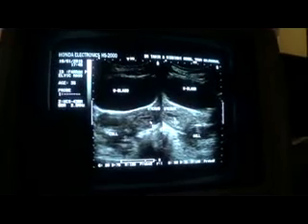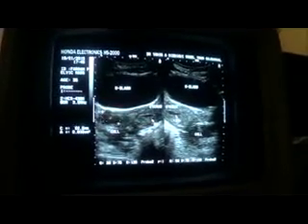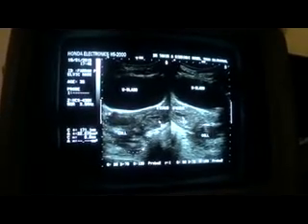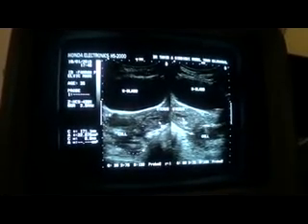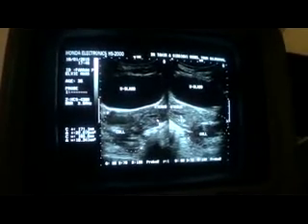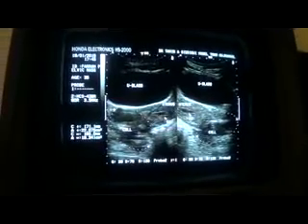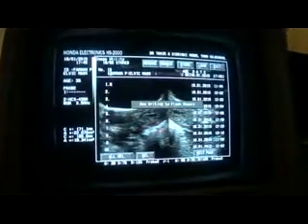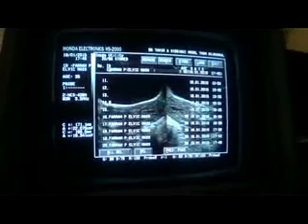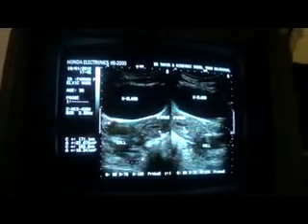Endometrial canal. Now this is the collection, this area. And you see the posterior wall, it's very difficult to get the posterior wall. I will recommend MRI or some other imaging modality in addition to this ultrasound of mine. Maybe TVS can be more helpful.